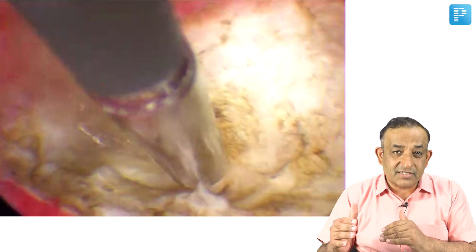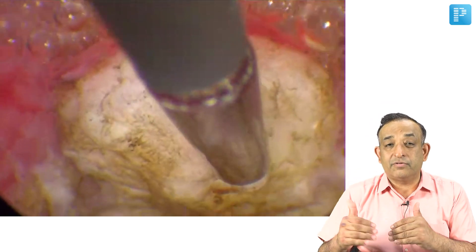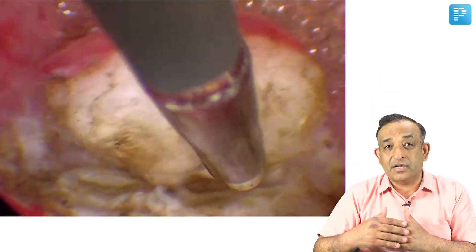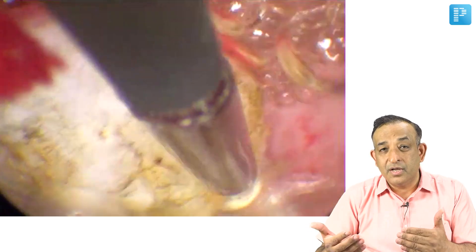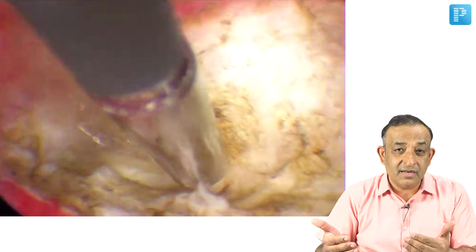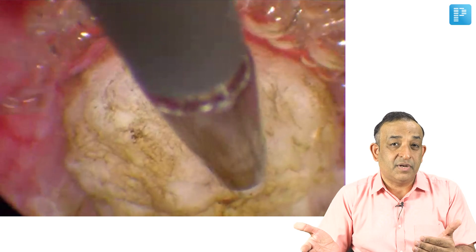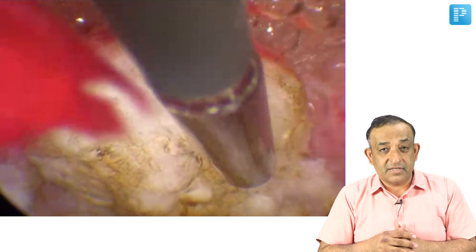At the end of this procedure, you must also take into account the amount of fluid you use. You should not make the patient go into fluid overload. When this is the case of hysteroscopic myomectomy we are using saline, so anything more than a deficit of 2500 ml of fluid means you should stop the surgery.